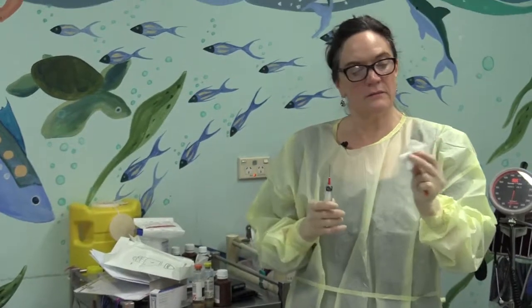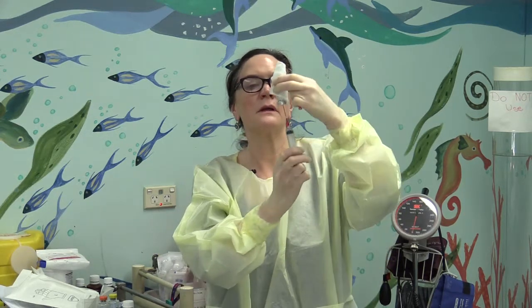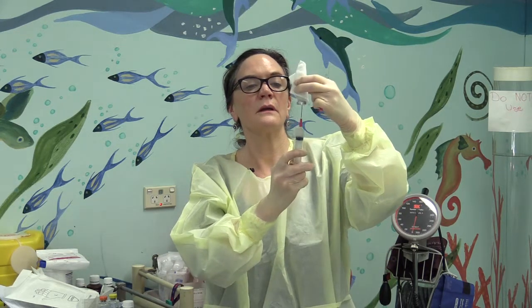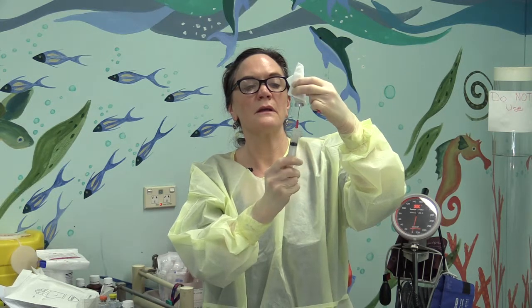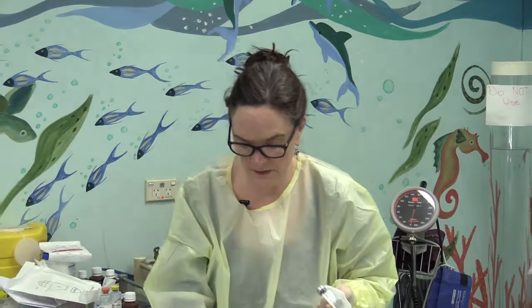I've made the cefazolin up to 10 mils, and I'm going to add 500 milligrams to this patient. That's the dose that I've worked out. So I have 100 milligrams per mil, which is 5 mils, 500 milligrams.